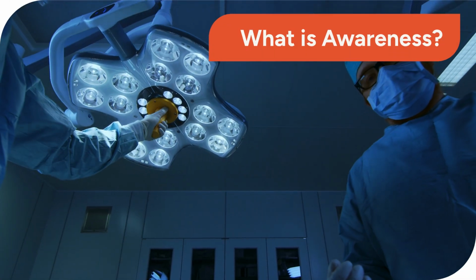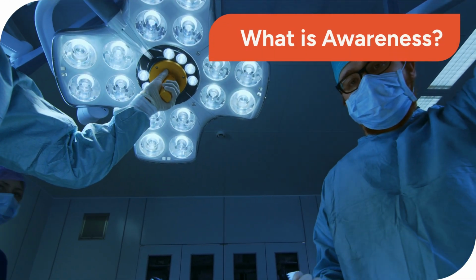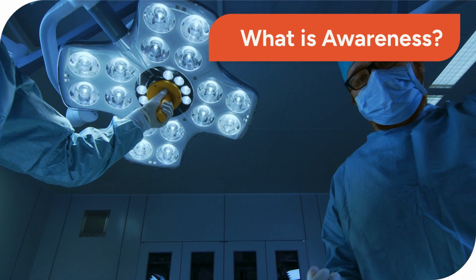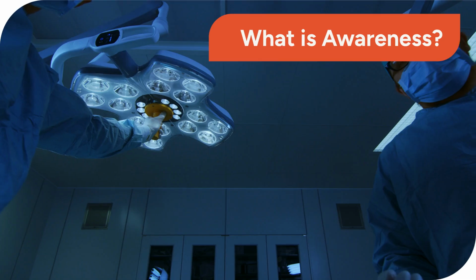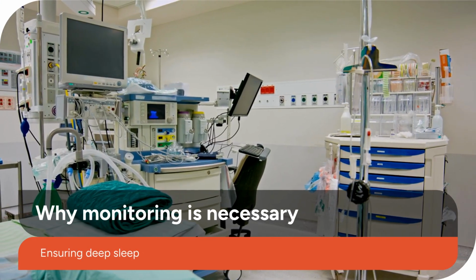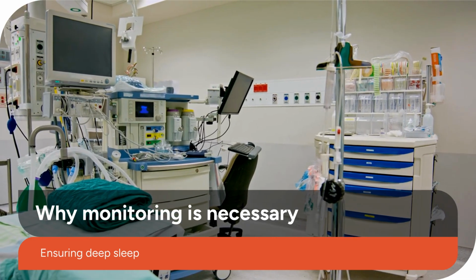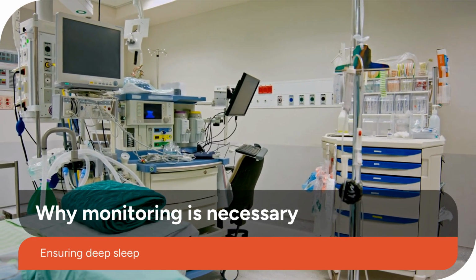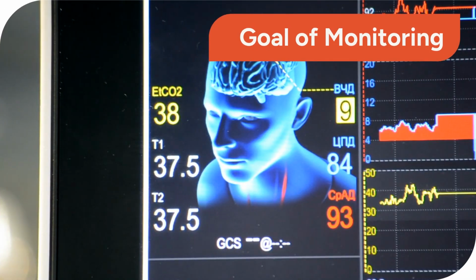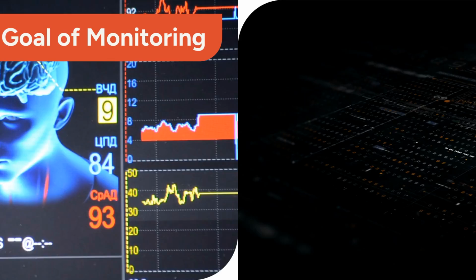Though immobilized and unable to respond, a patient experiencing awareness might feel pain or hear conversations, leading to potential long-term psychological impact. Standard vital signs like heart rate and blood pressure don't always reliably indicate the depth of unconsciousness. Hence, specialized brain monitoring is crucial. The primary goal is to maintain an optimal level of general anesthesia, deep enough to prevent awareness, but not excessively deep, which can increase risks.